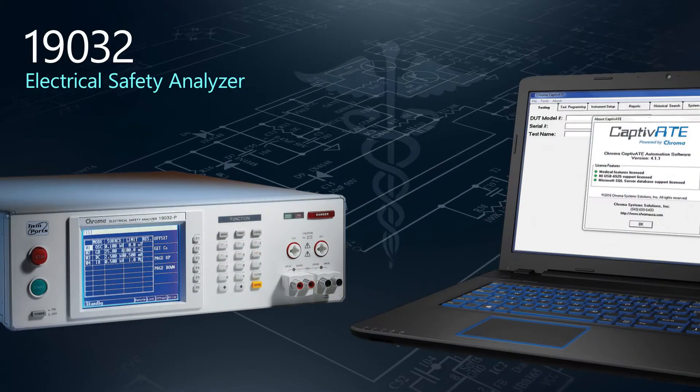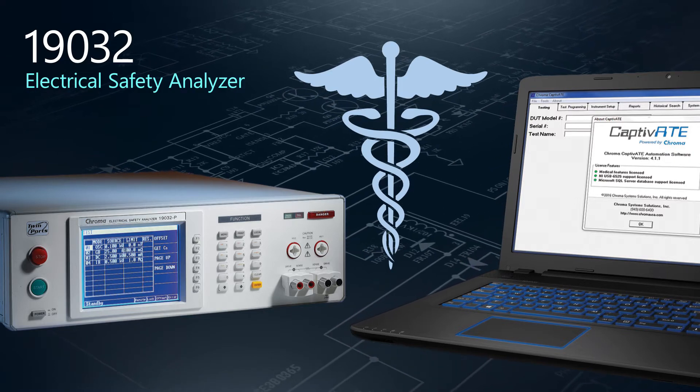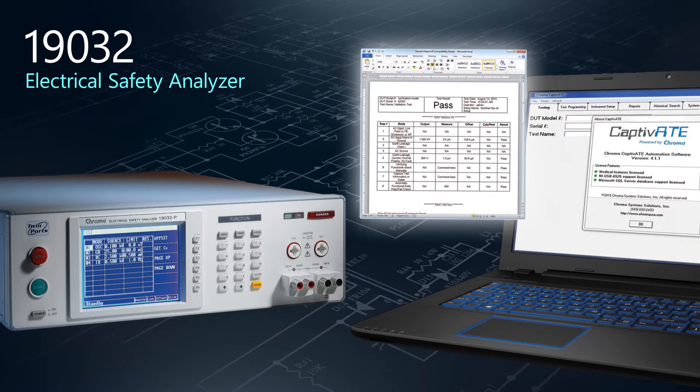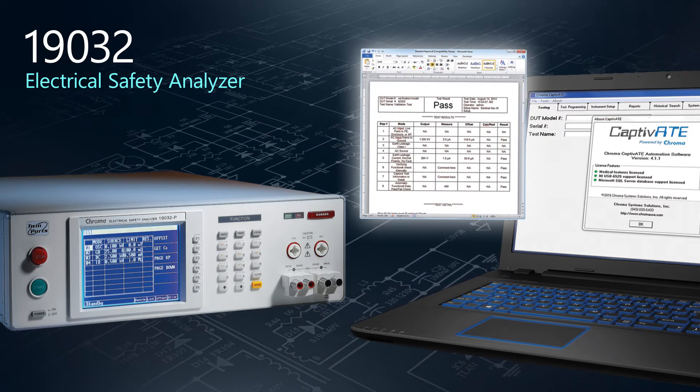The 19032 is the core of our medical device automated test systems. Paired with our Captivate Automation software with built-in IQOQ protocol documentation, you can be sure your IEC 60601 test requirements are supported.